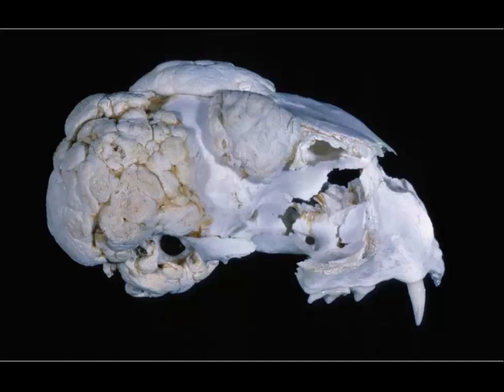Okay, this is one that you might have read in books. It's more of a historical condition. We don't see it anymore. And we're looking at the skull of this cat, and you can see these large areas of proliferation of the bone. These might have started out as exostoses. At this point, they are multiple cranio-osteosarcomas. If you want to call them osteochondromas or chondromas, I will give you partial credit, but at this point, they're usually considered to be malignancies, and they are osteosarcomas.